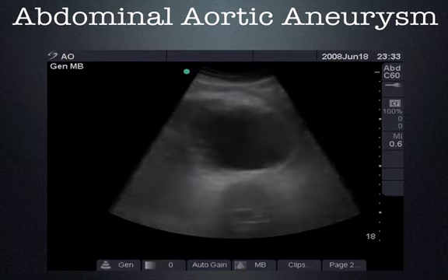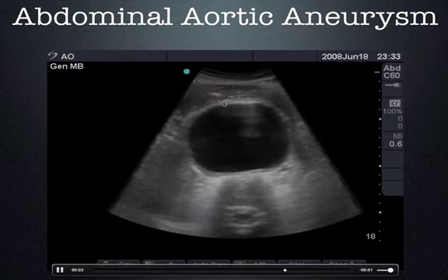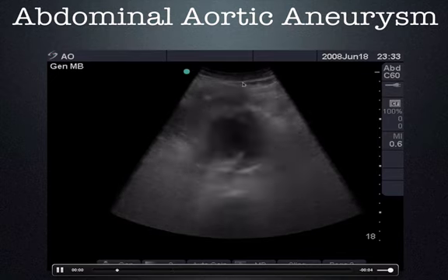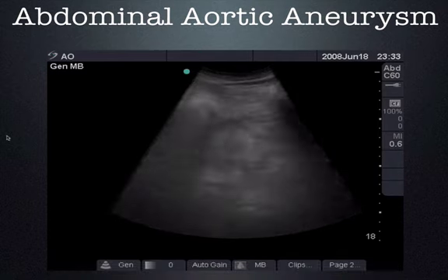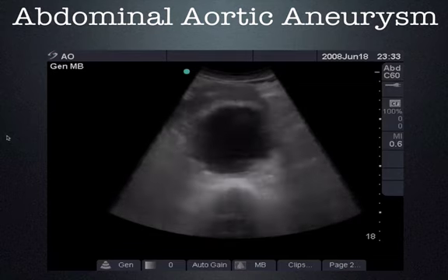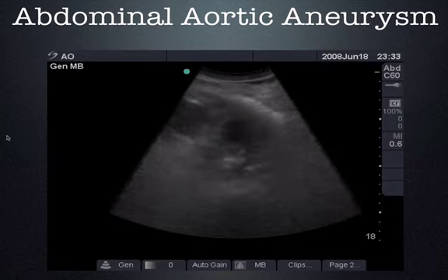So you can see here a key point is illustrated. The abdominal aortic aneurysm, the most anterior surface of it, is only about 2 to 3 centimeters deep under the skin. So most large aortic aneurysms, even though bowel gas and body habitus are major limiters, if there is a large aortic aneurysm, oftentimes it'll reveal itself to you with minimal pressure.